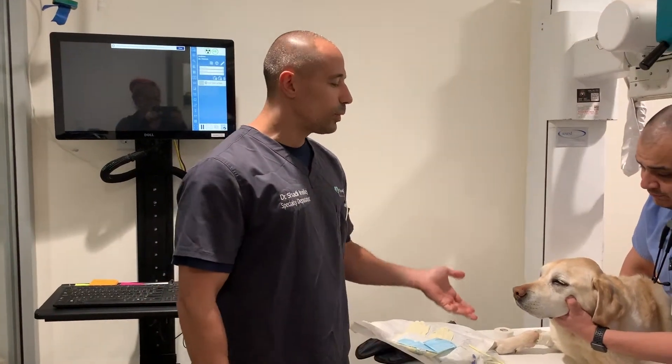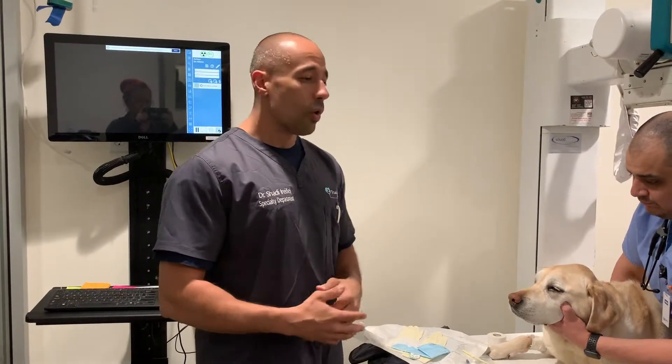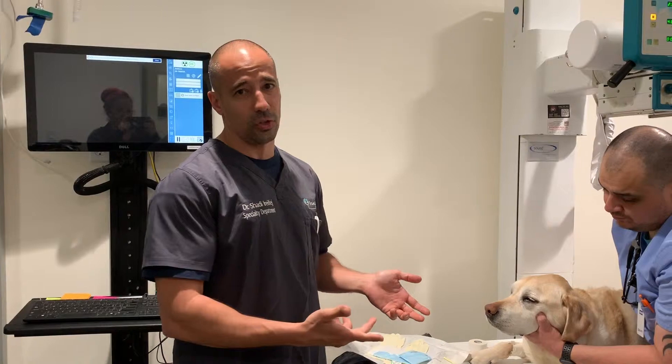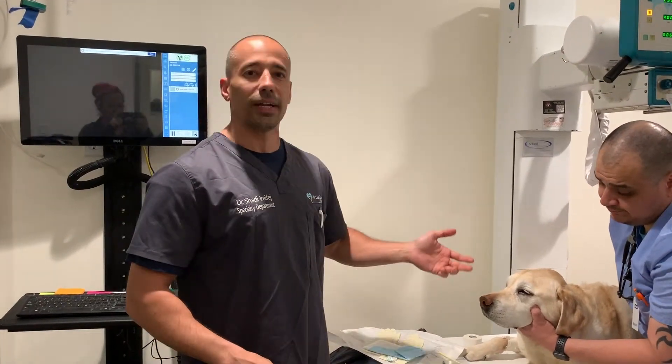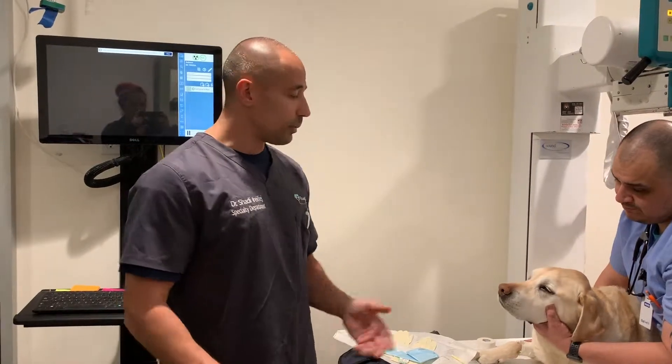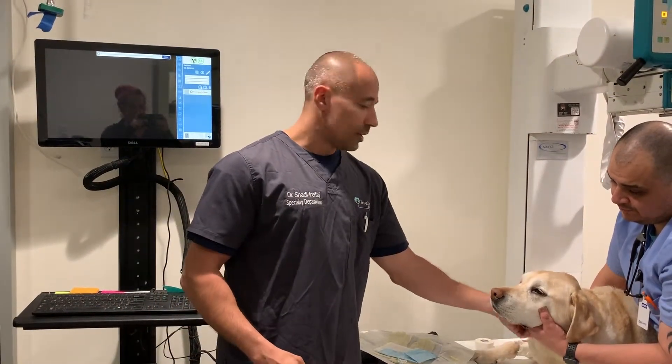It's the type of feeding tube that we use in some dogs — for dogs that aren't really eating very well and we need to get them started on some food, or in dogs that continue to vomit, if you want to empty out their stomach, we'll place this feeding tube. It works very nicely for dogs that are kind of docile.